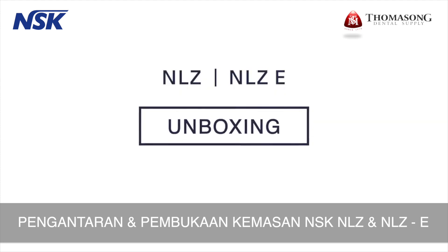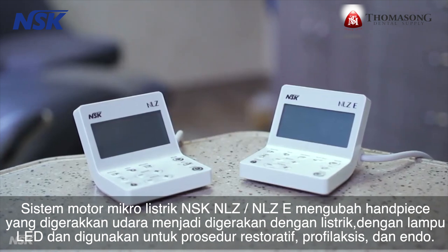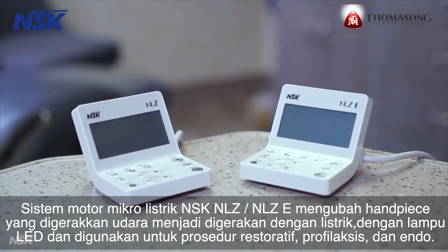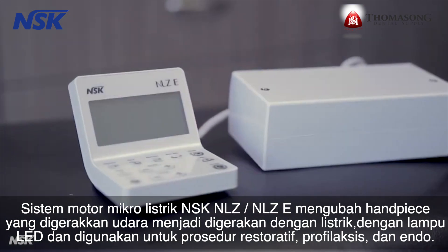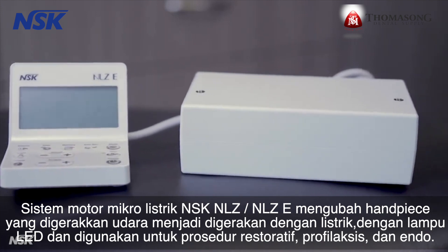The NSK-NLZ and NLZ-E electric micromotor system converts air-driven handpieces to electric with LED light and is used for restorative, prophylaxis, and endo procedures.